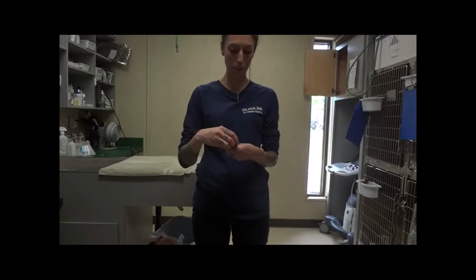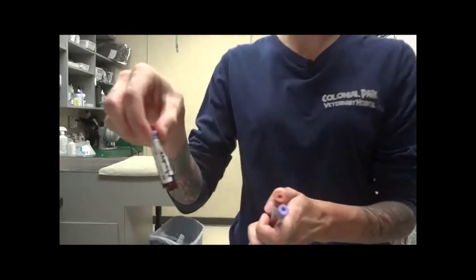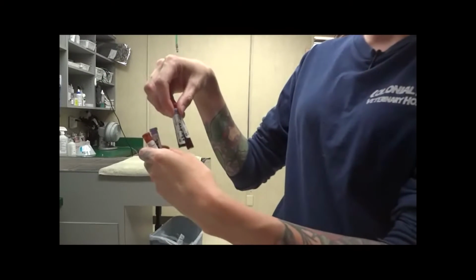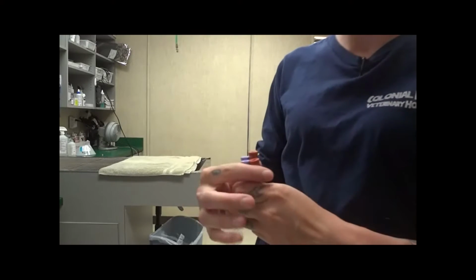We will be performing a cross-matching procedure today. I've collected our blood in an EDTA and a red top tube. We're going to let the red top tubes sit for 30 minutes to clot while we spin the purple top tubes down.